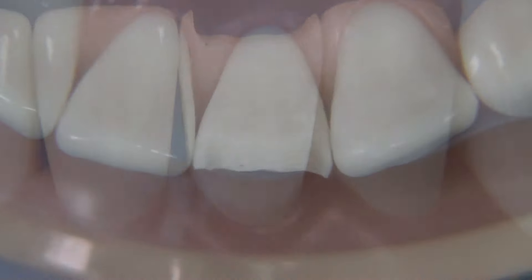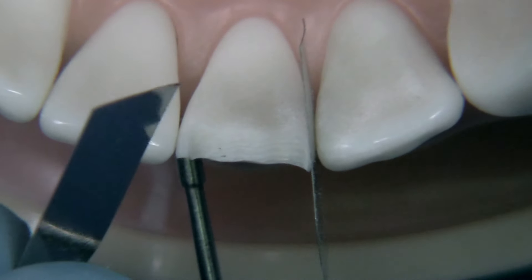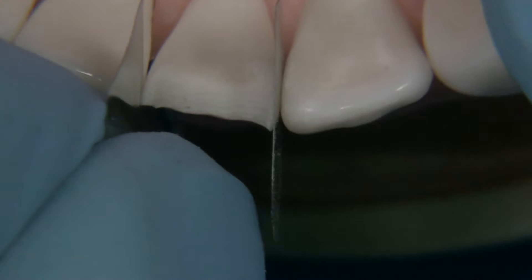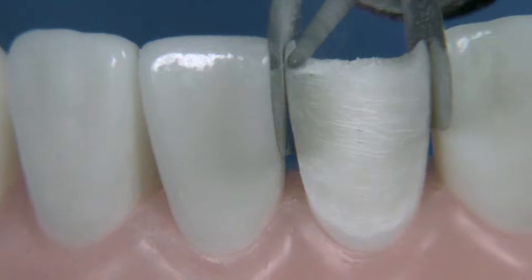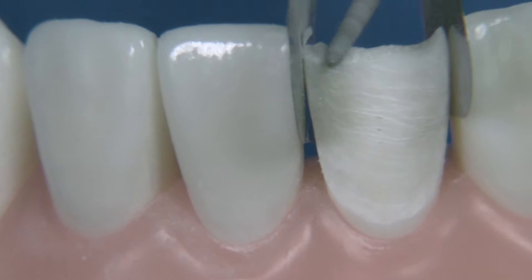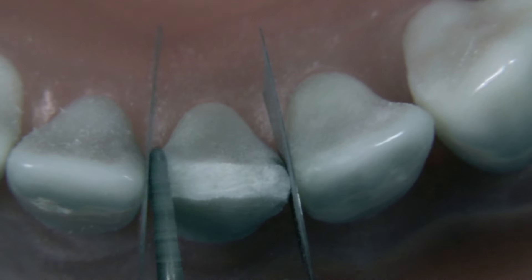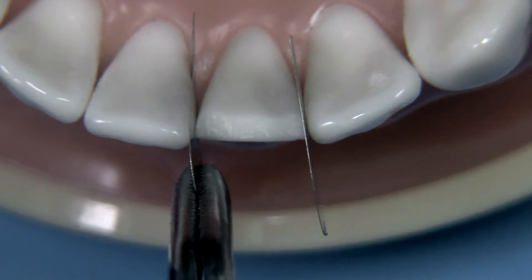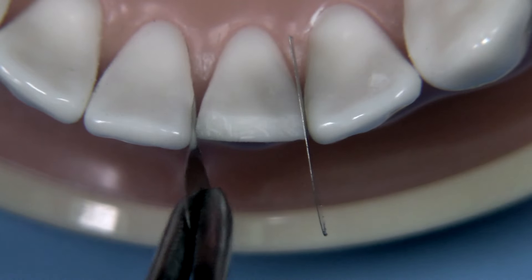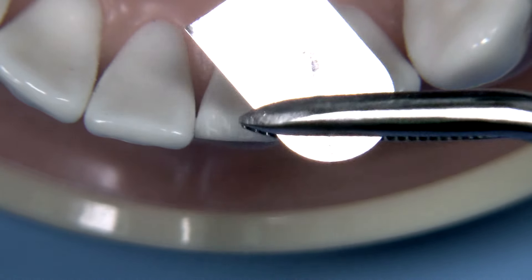I find it helpful when doing just a single veneer to utilize some kind of a protective matrix shim. I can use an instrument to create a little separation between the teeth and then insert a couple of standard metal matrix bands — the type you would use for an amalgam restoration — and you can see that they'll provide you with adequate protection when you're removing the little peaks near the adjacent teeth. Notice it's just a straight butt joint and we're not going to wrap on the lingual at all. You can leave the shims in or take them out — you can see there's a little bit of damage to the shim, which tells us that it was very helpful.